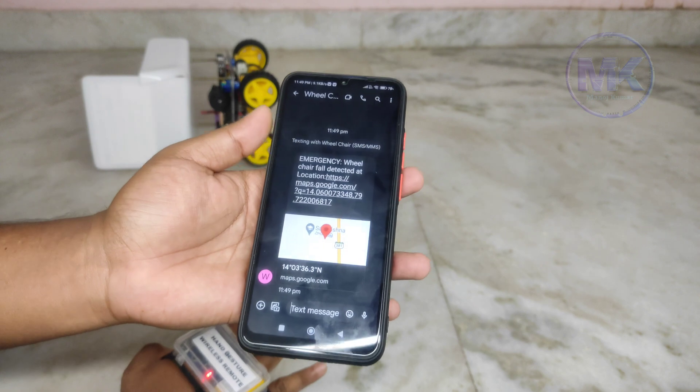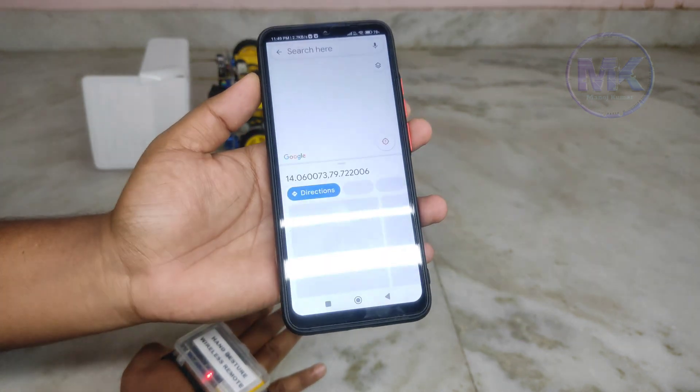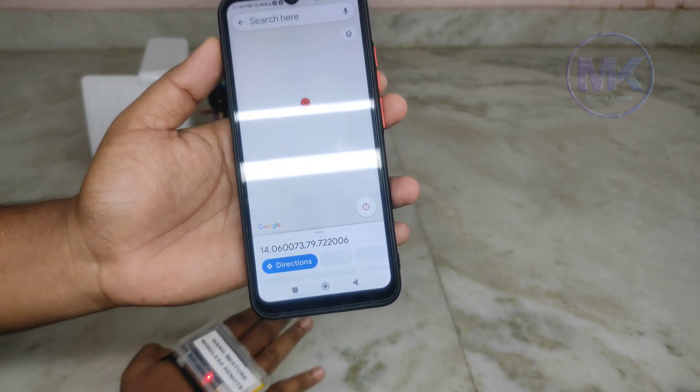The wheelchair has sent an emergency message to this mobile. This message consists of the wheelchair location in Google Maps link format, so when we click on this link it will directly open Google Maps and display the exact location of the wheelchair.